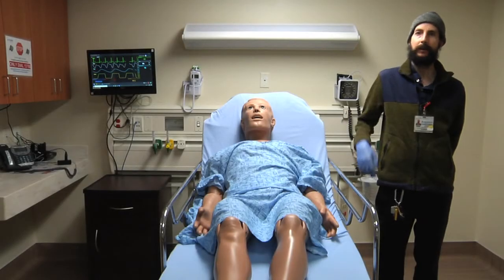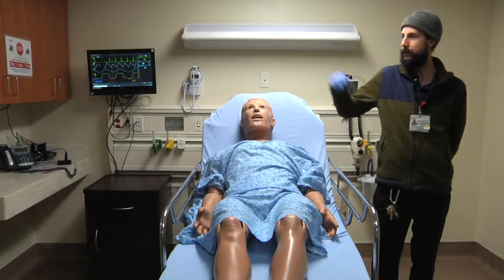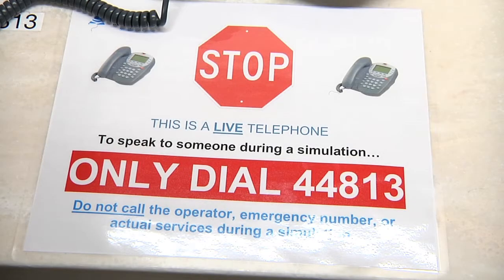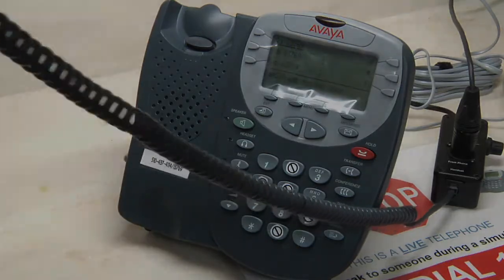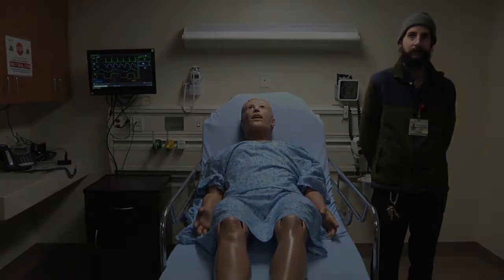So we also have our very own paging system down here in the Sim Center, so we can make announcements into the room. So our phone is a live hospital phone, so please follow the instructions on the sheet and only dial that number. When you dial that number, you'll be connected to our control room operator. They may then connect you to your doctor or whomever you are asking for.